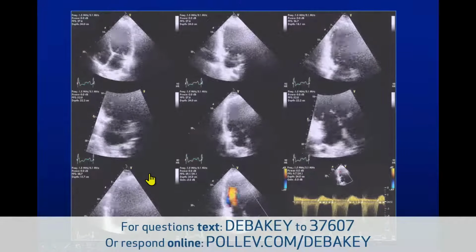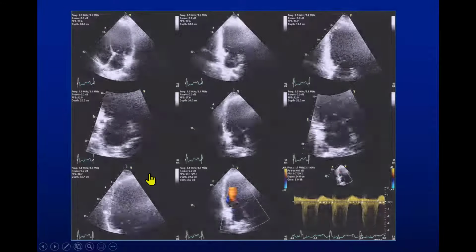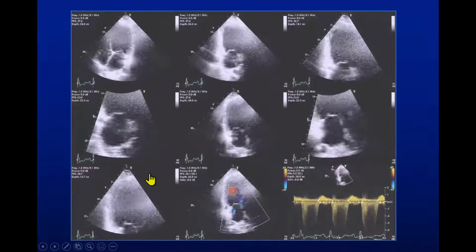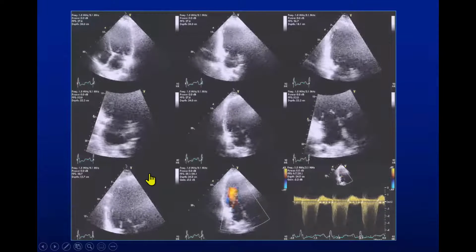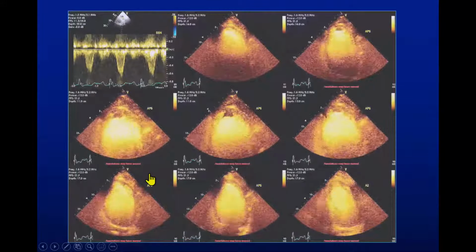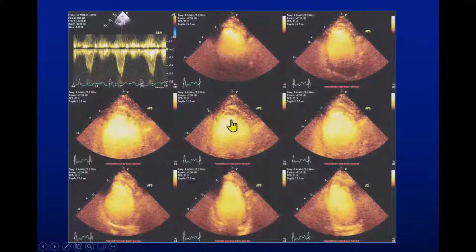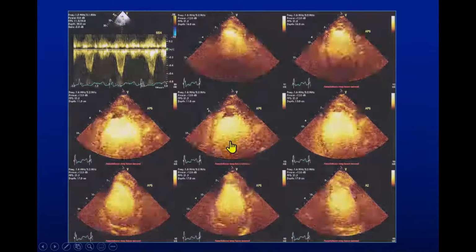Notice in this case here, for example, again in a 9 display, I can understand and I can interpret a significant depression in ventricular function. Hard to tell all the wall motion, whether all of it is abnormal, yes or no, but I cannot tell more than that. This is the same case, showing that indeed there's diffuse hypokinesis with some akinetic segments, but on top of that, there is a nice thrombus in the apex that will change clinical management on this patient, putting them on anticoagulants.